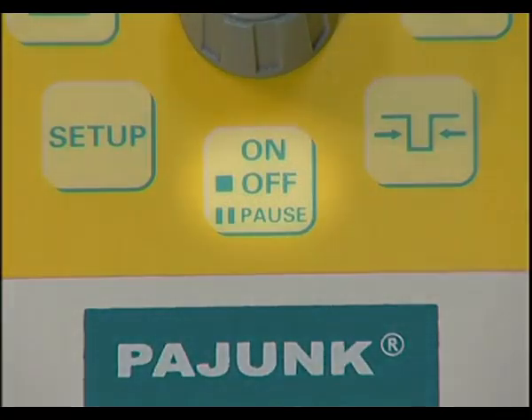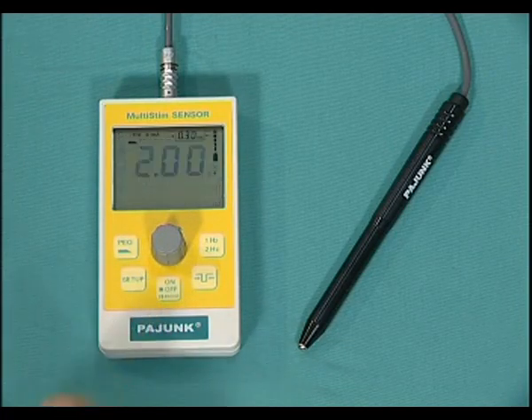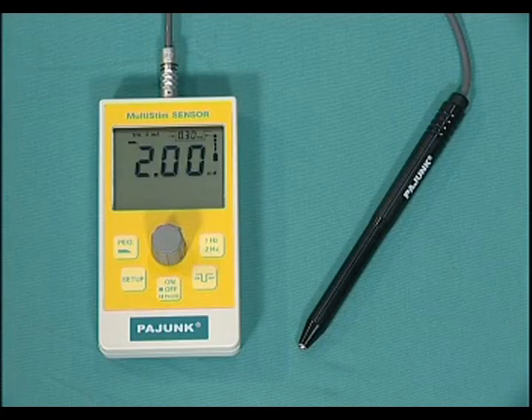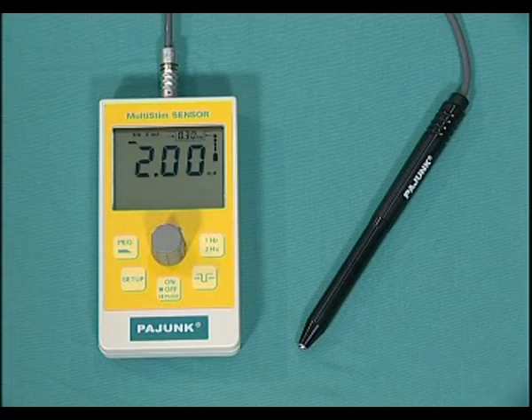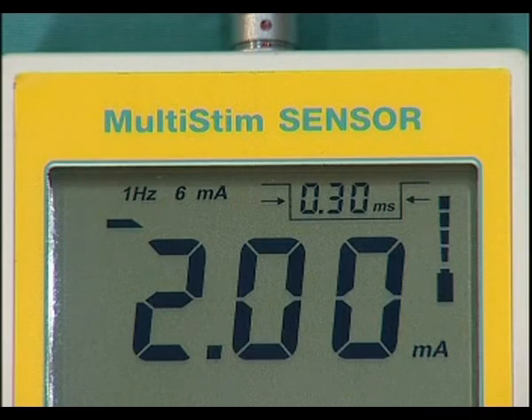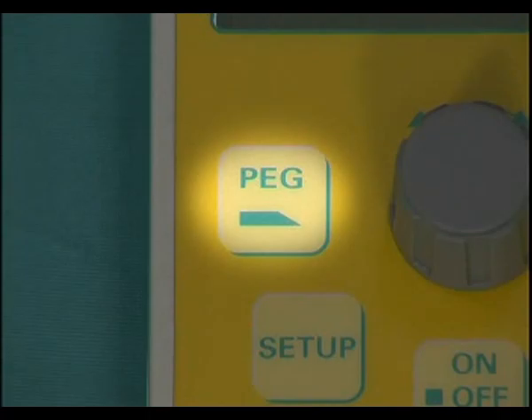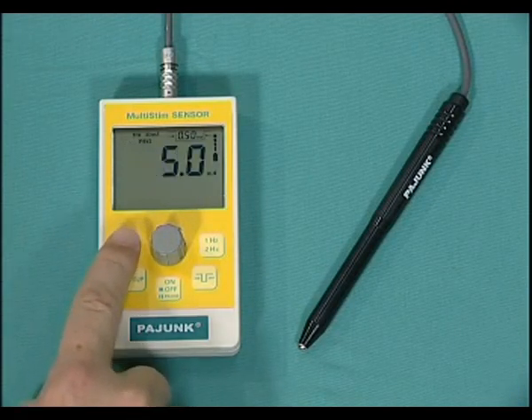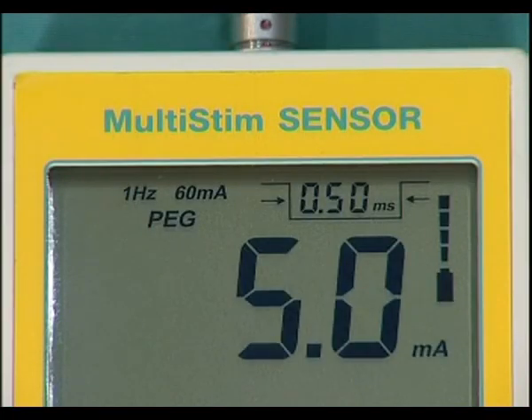To start, press and hold the On button. The Pajunk multi-stim sensor will automatically conduct a self-test, then default to pause mode, where the LCD display will flash. The sensor will automatically start in needle mode and display the pre-programmed setting shown here up to a maximum of 6 milliamps. To change to PEG mode, press this button. The display will then show the pre-programmed PEG setting up to a maximum of 60 milliamps.